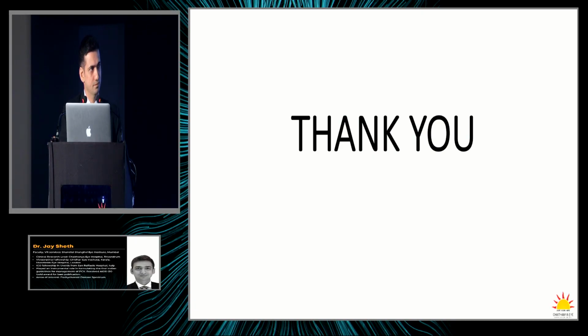I think having an order of imaging is also helpful because sometimes if you start the patient with autofluorescence and he's exposed to bright light, he might be very tired or photophobic by the time you're doing your OCT angio. So having a certain order or protocol in your clinic can be helpful as well.